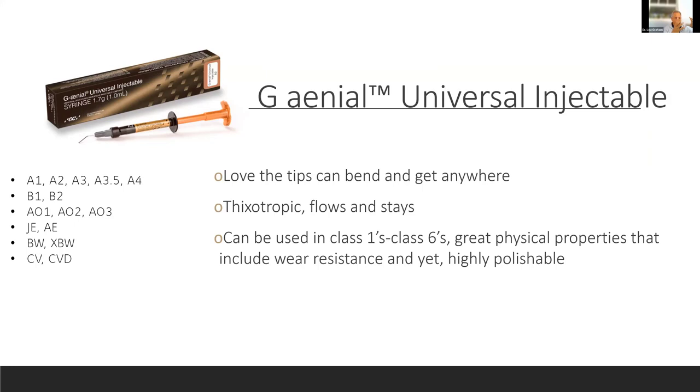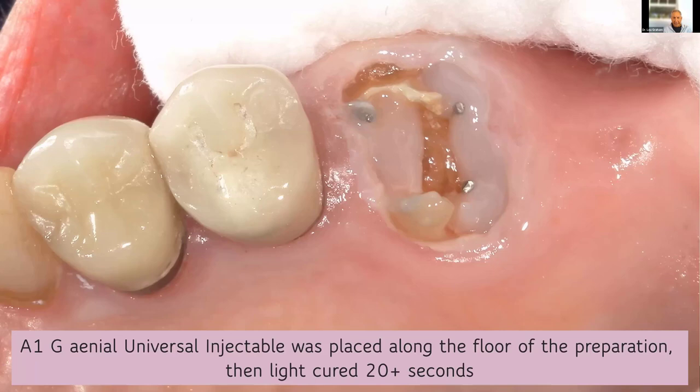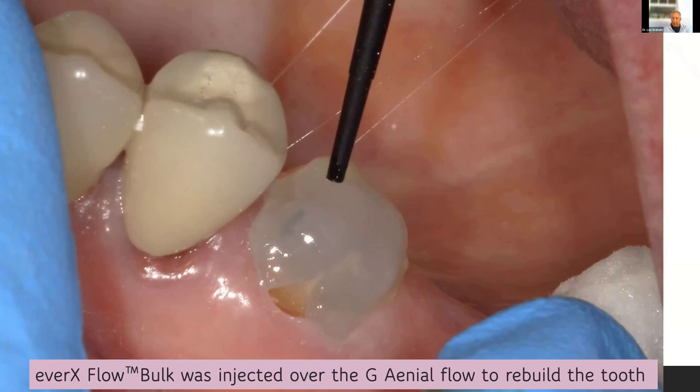It comes in all these different colors — I couldn't care less about the color in this case. I'm going to pick a light color because the lighter the color, the faster it cures. I'm lining my gingival margin because I'm going to raise my margin. Just lining the floor — light cure 20 to 30 seconds. Then I'm placing my EverX Flow Bulk Fill: one big layer, let it self-level for 5 to 10 seconds, I really don't have to manipulate it at this point — it's a bulk fill. For final preparation after diamonds, I go to fine diamonds because margins have a much better chance against micro-leakage with fine-finished margins. I finish everything with fine-finishing diamonds — these are the Robot burrs from Shofu.